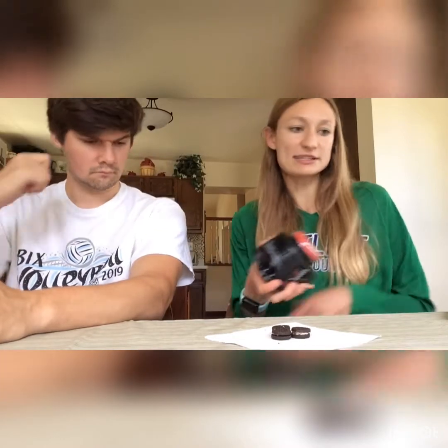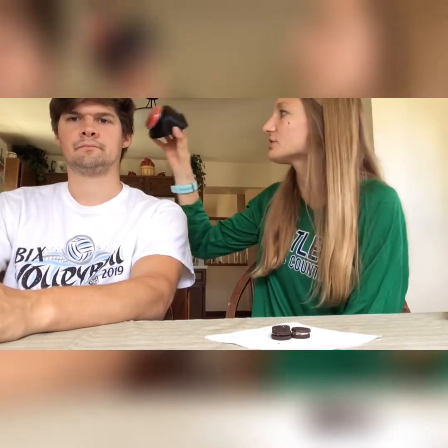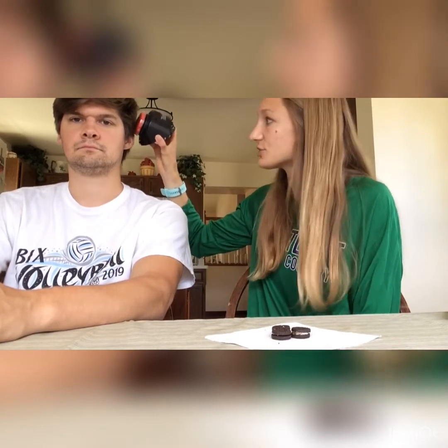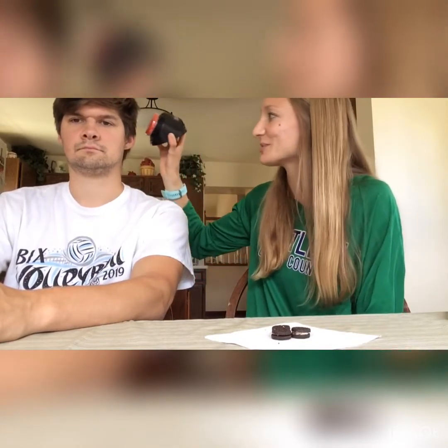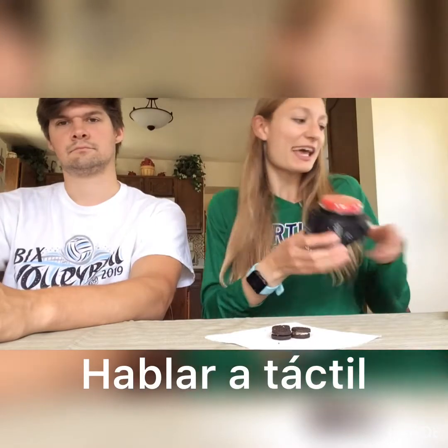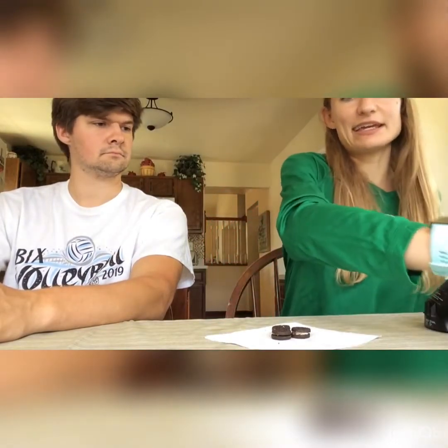Sometimes that isn't always the case, and in those situations, I would probably add a verbal prompt in after waiting another 5 to 10 seconds. So the tactile prompt, still not answering, so I'll say, hey, switch is over here. Oh, the one thing you need to be careful of is not to hit the switch yourself with them too. You just want to gently touch them. Hey, your switch is over here. Cookie.